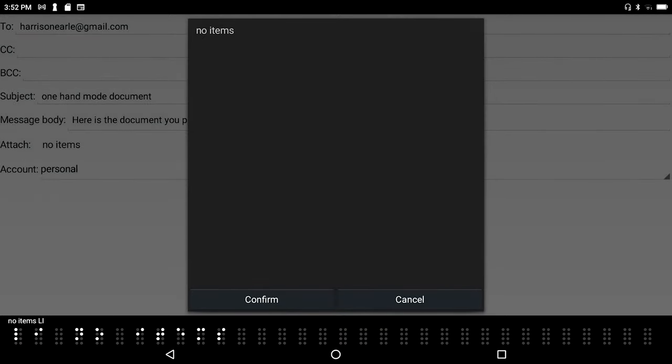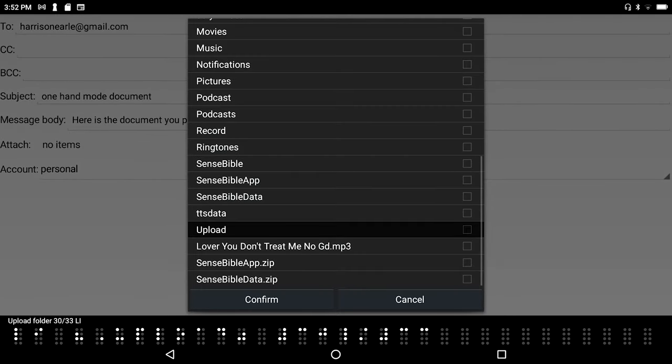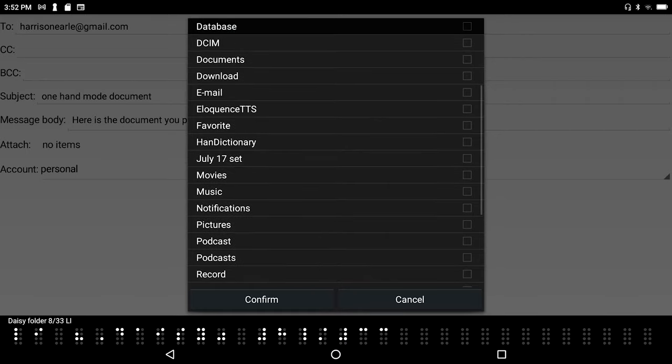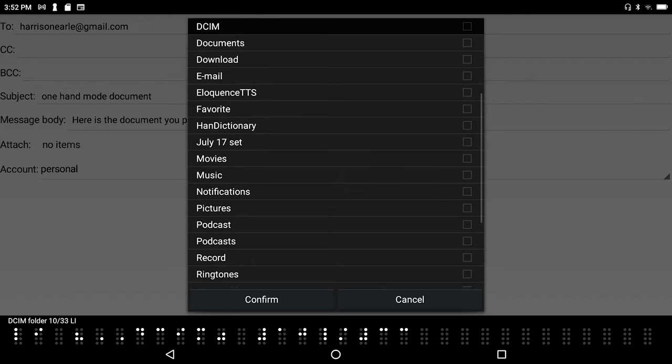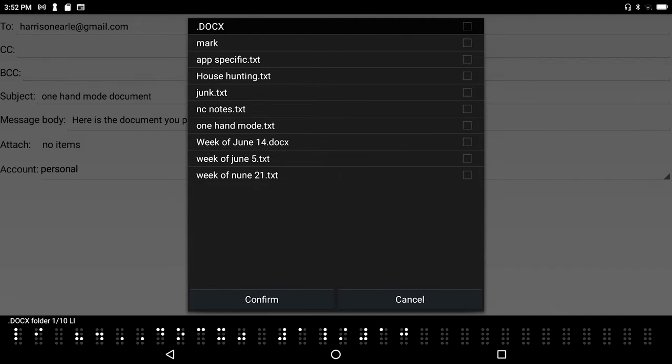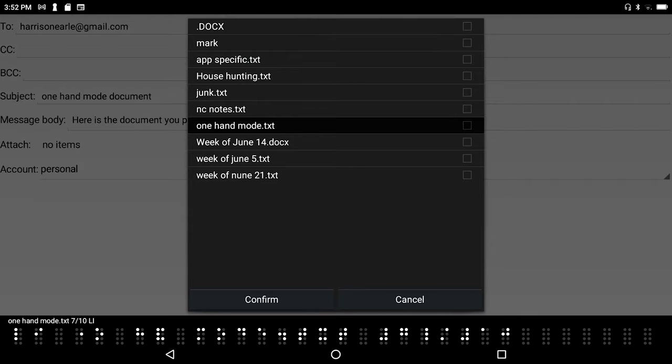I press enter on it and I hear 'no items in list'. I happen to know that the default folder is the upload folder, so I'll press backspace to move up one level in this folder structure. I'm just going to press D until I get to documents, that's at the root level of my flash disk. I'll press enter on it, press the letter O, and there's my one hand mode document.